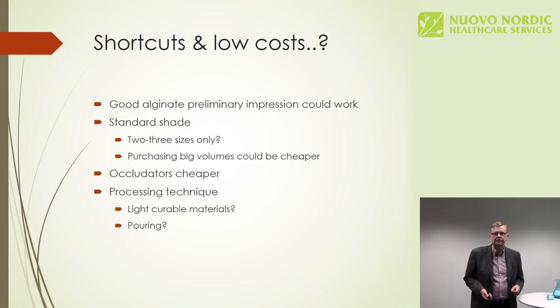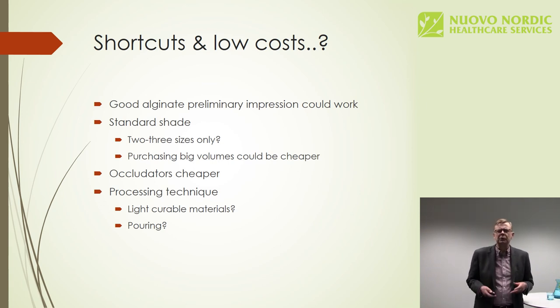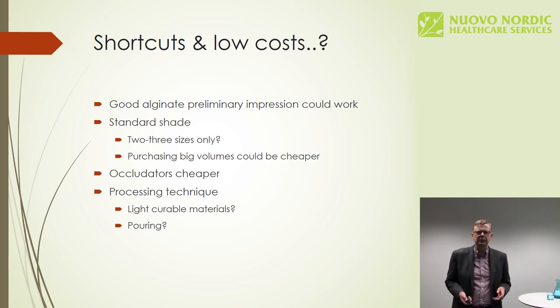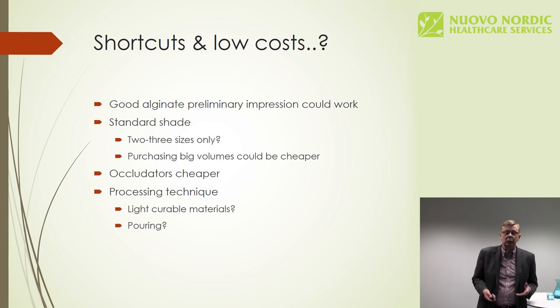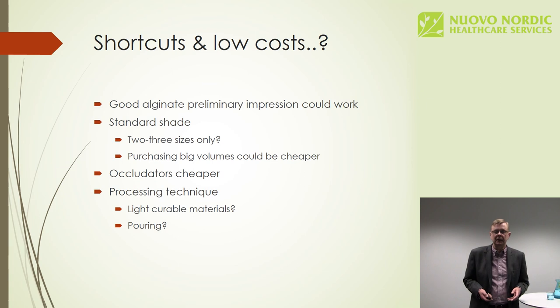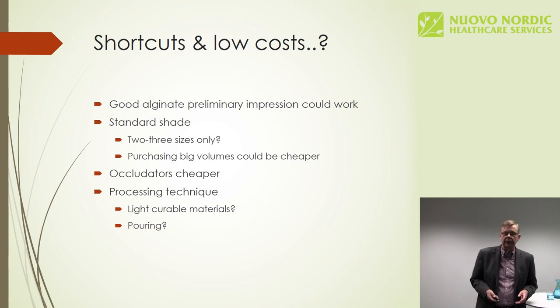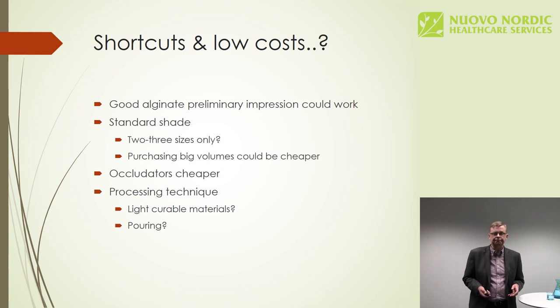As I mentioned before, I have made some shortcuts, or I'll provide you with some shortcuts for the fabrication process, mainly in the impression part, which means that in this presentation we'll use the alginate preliminary impression for the fabrication of the lower denture. However, for the maxilla, we'll take an impression with a border molded custom tray.